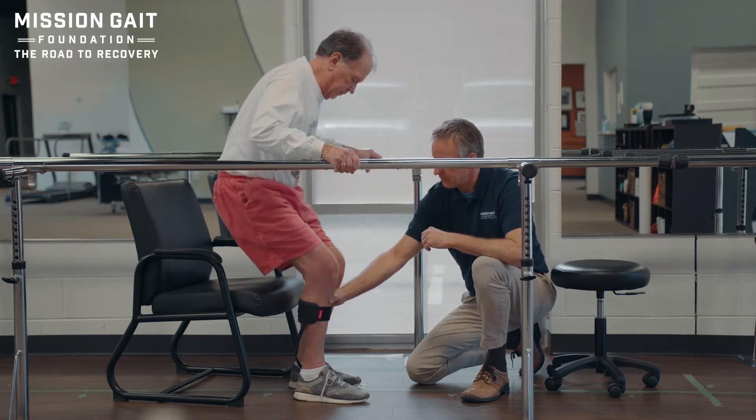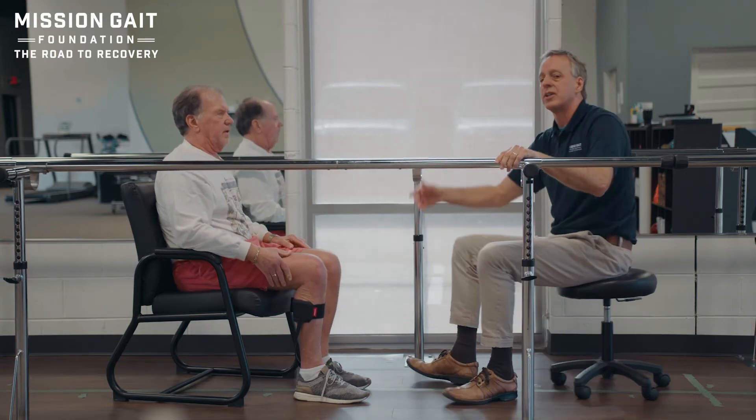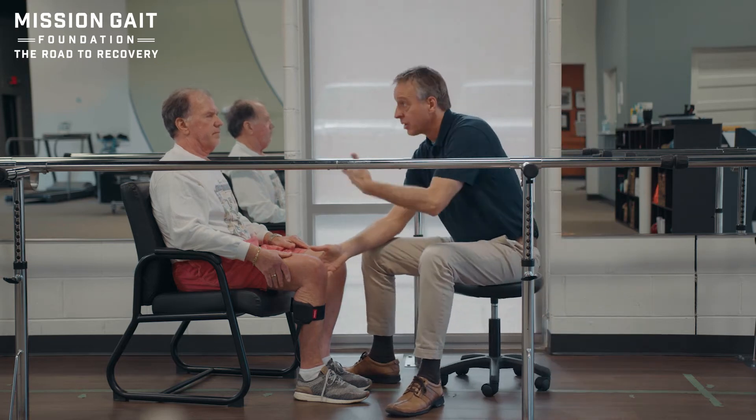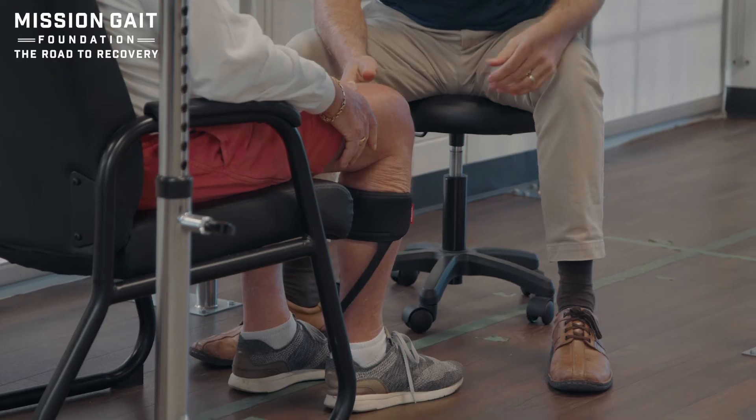From there, I'm going to have you sit down. Many times at this point the patient would be told, okay, you're good, you can take the brace - it fits you. But the issue there is that the patient doesn't know how to put the brace on themselves. So I really want the patient to understand this and get the sense of how to do this yourself.